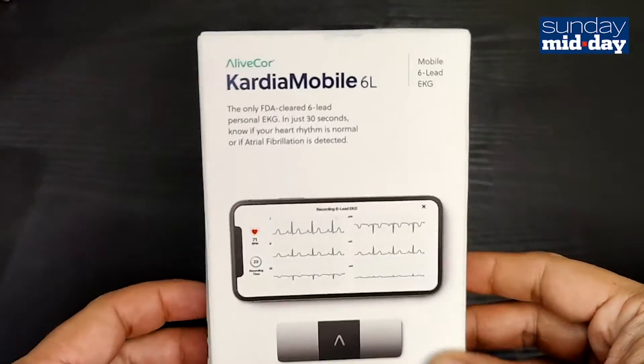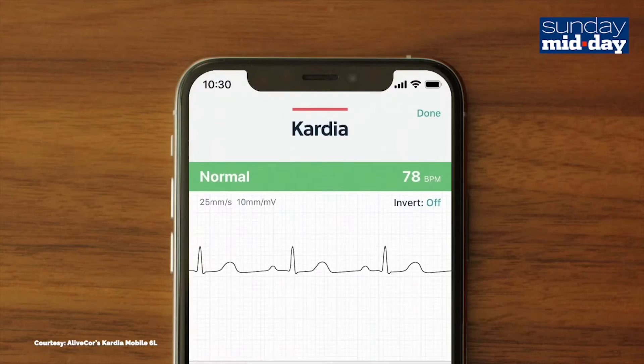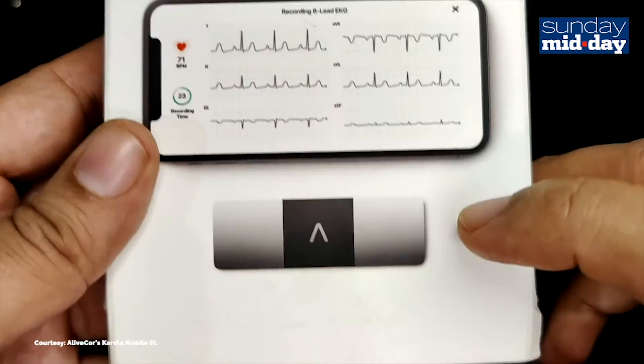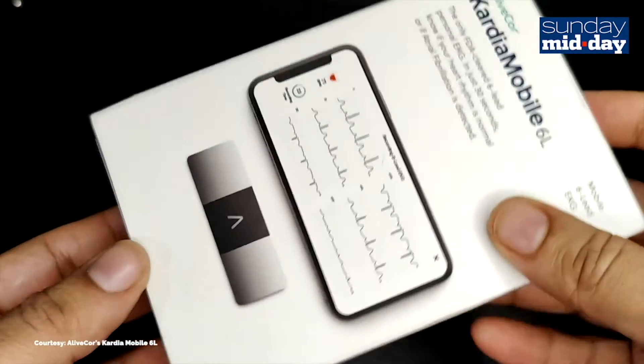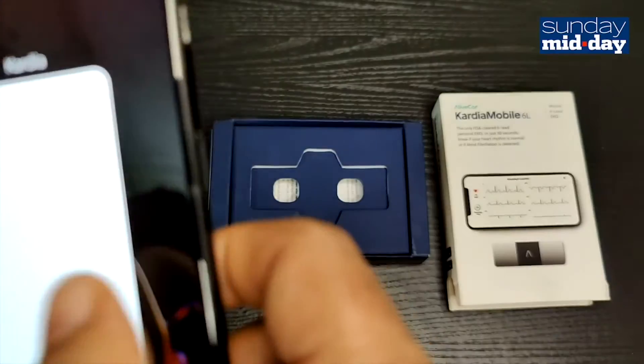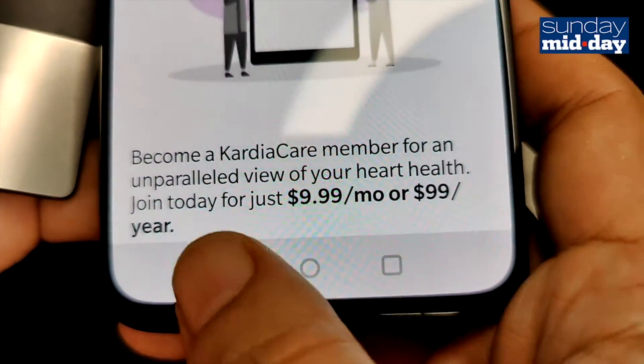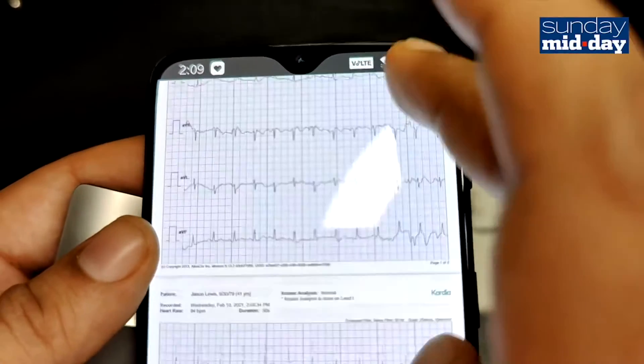The Kardia 6L is a very cool-looking device and does everything it's supposed to. However, I don't see its use beyond the medical scenario where a doctor might want to remotely monitor a patient's heart — for that purpose, the cost of $149 seems entirely justified. The Kardia app also has a built-in care package they charge $99 per year, offering monthly health reports, medication tracking, and automatic ECG sharing.